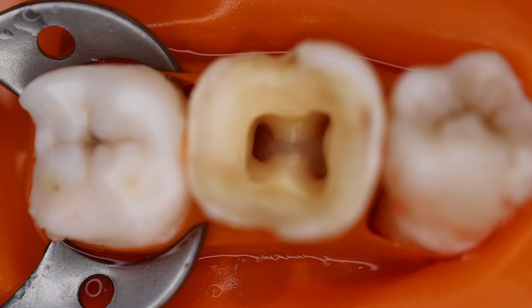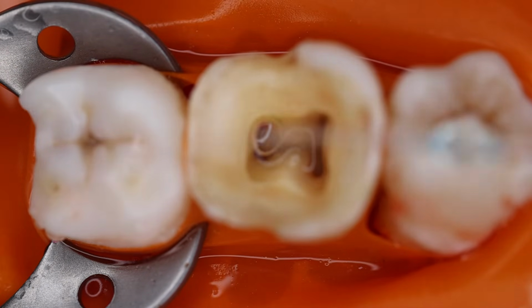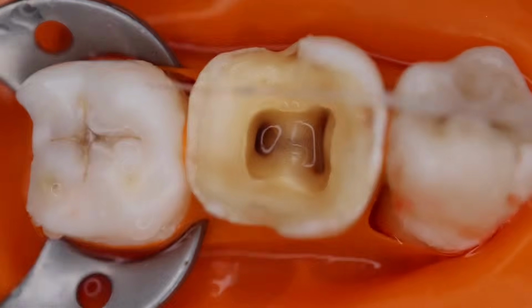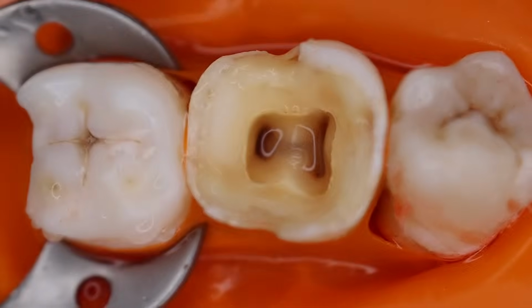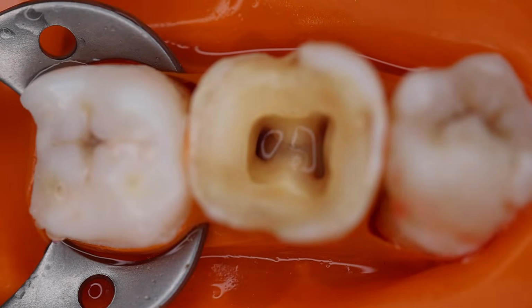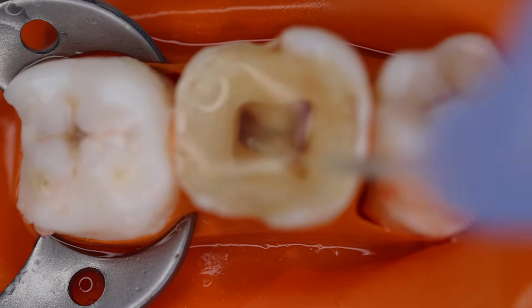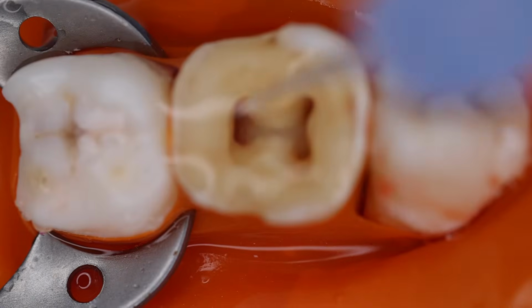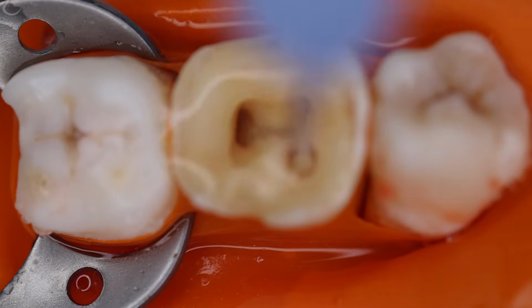Start using the sodium hypochlorite initially only with a side vent needle. So this is a side vent needle. See, this is a side vent needle, and with this needle you are going to initially introduce it into the canal orifices. We have not yet determined the working length.